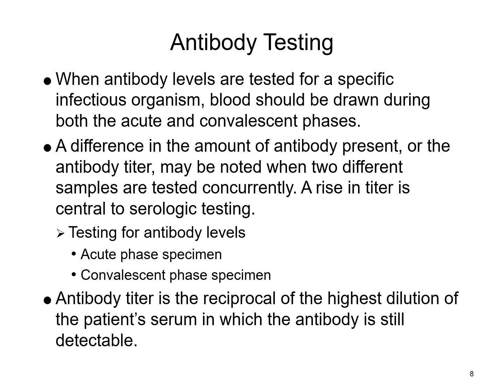Because if you draw a specimen at the acute phase, you may or may not have those antibodies present. Then as that convalescent phase sets in and those antibodies start to rise, you're going to see a higher spike in them, which means that when you start doing that testing during that convalescent phase, you're going to get those strong positive reactions.